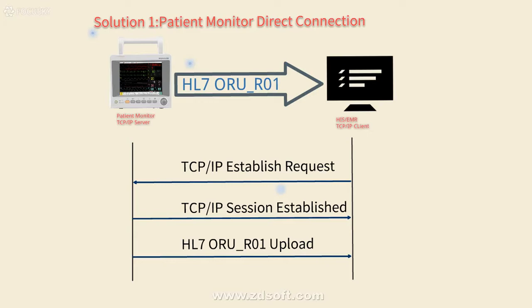The TCP/IP will establish a connection request. Once the connection is established, the patient monitor will upload the information using the HL7 format.